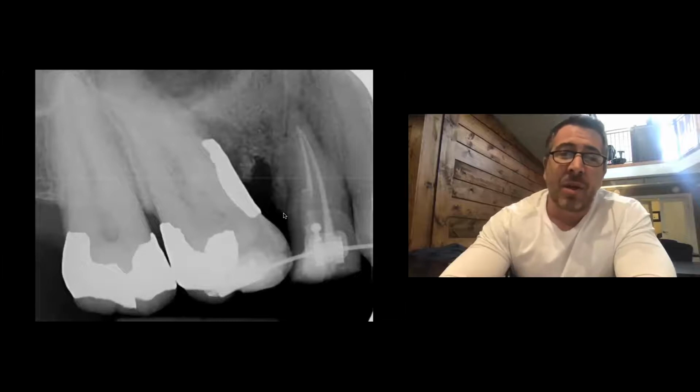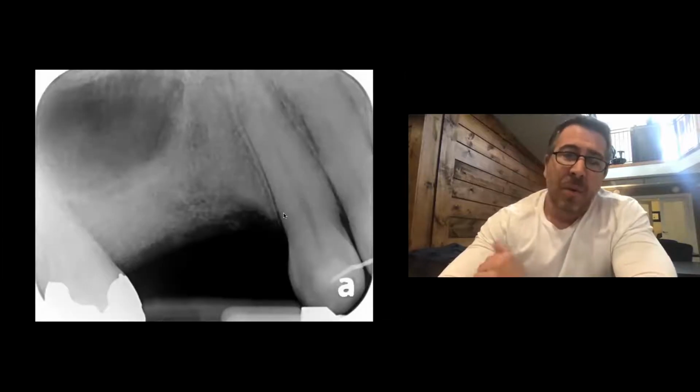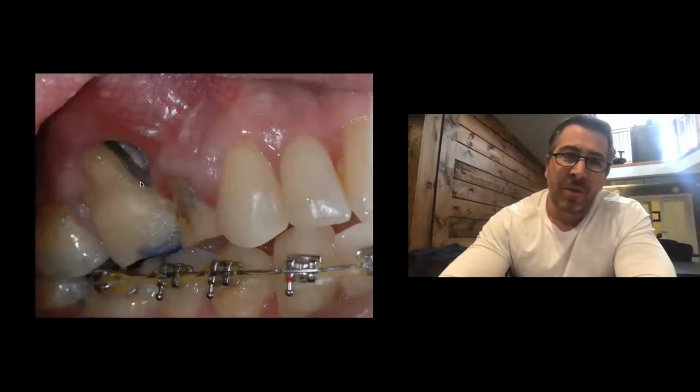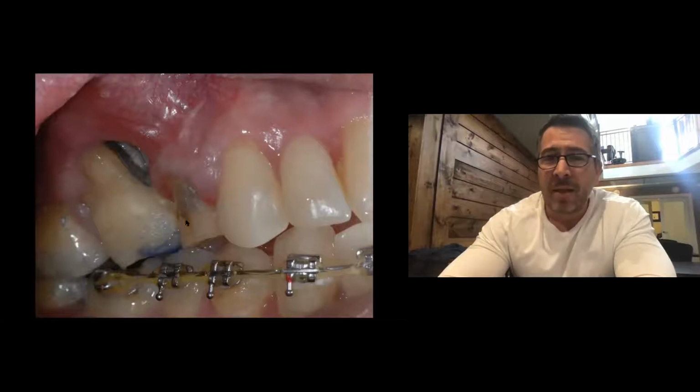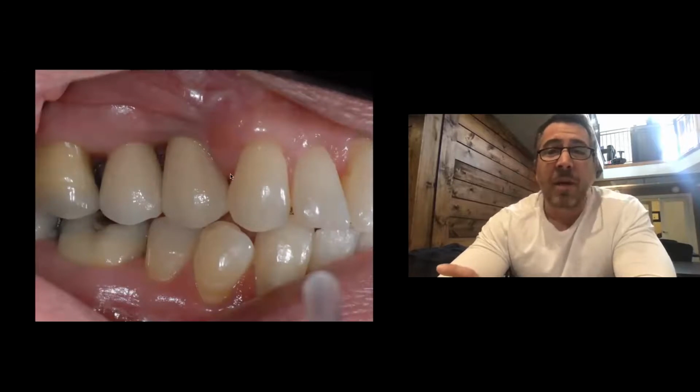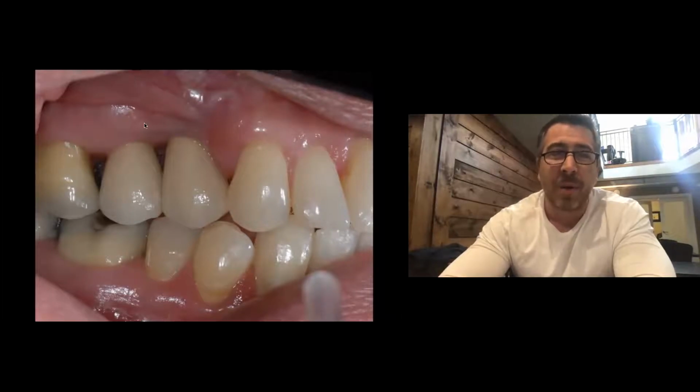And what did that result in for us clinically? We sacrificed the teeth after we did our orthodontics and our grafting. This is the tooth pre-treatment. You can see that amalgam up the mesial surface of that molar. There's that endo-treated tooth that we've reduced and super erupted. And we end up with a pretty decent result. I mean, if you look at where that tissue level was on that molar, that amalgam was going way, way up to the zygoma almost. And now we got a pretty decent predictable result.